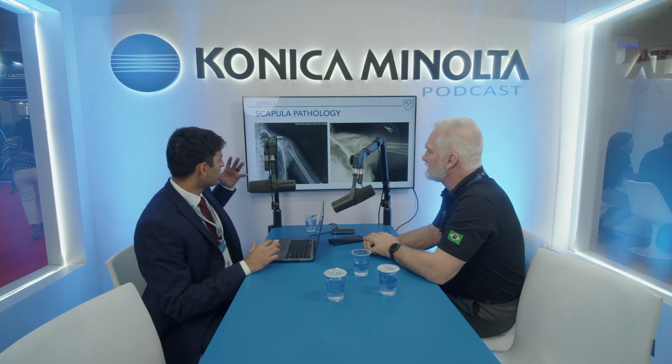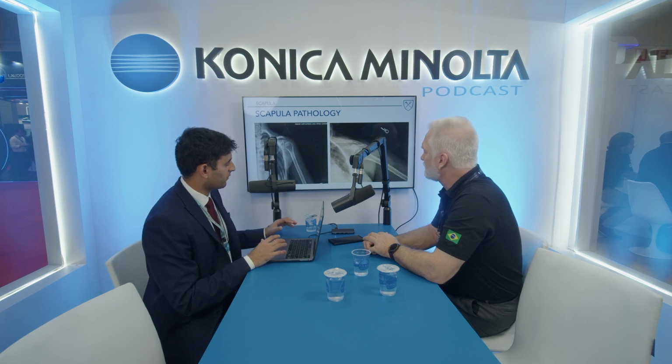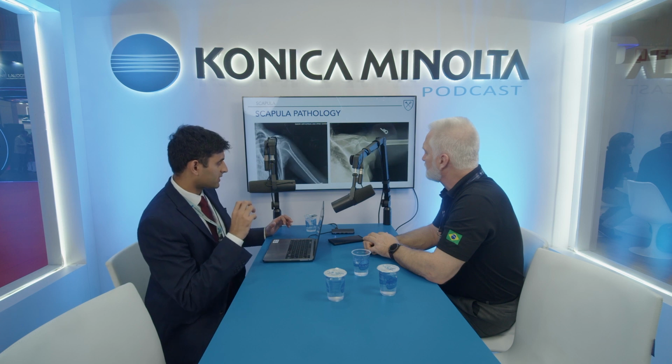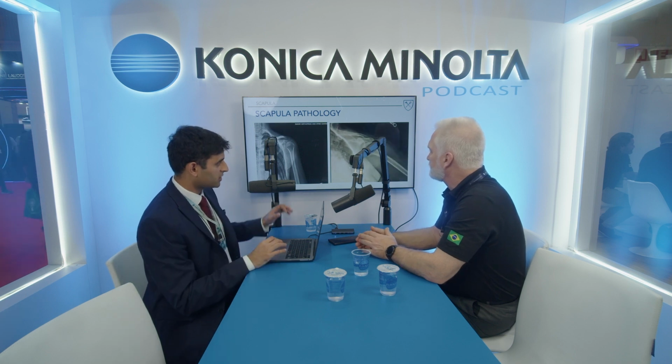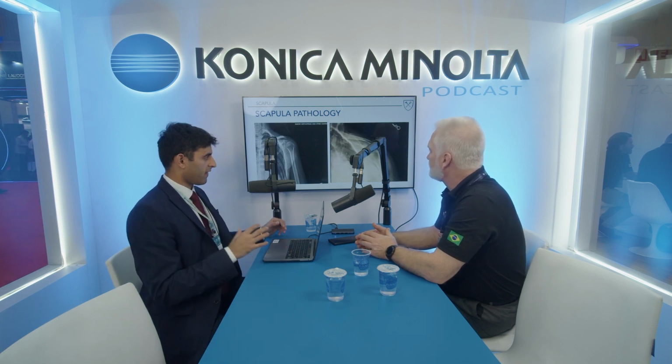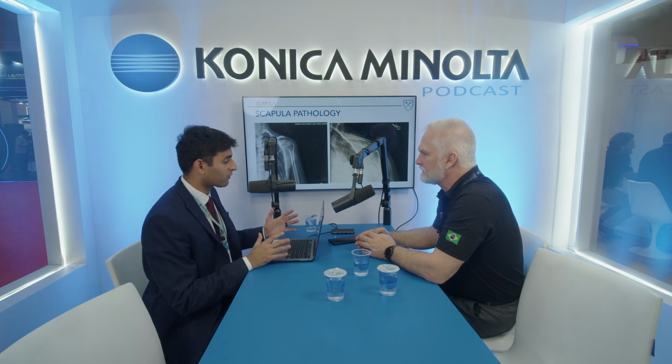For example, on the image on the left here, you can see that the scapula is totally paralyzed. It's not moving at all. It's not externally rotating like a typical scapula would upon humeral abduction. On the image on the right, you can see that the scapula is protracted. It's moving in a dyskinetic pattern, and it's again not allowing the humerus to be abducted because it's impinging on the acromion just above it. And this information was previously not available before DDR.